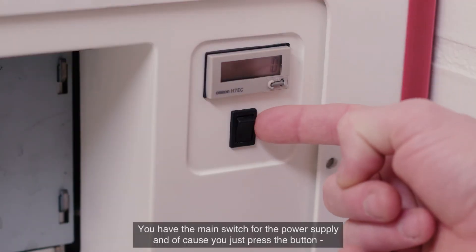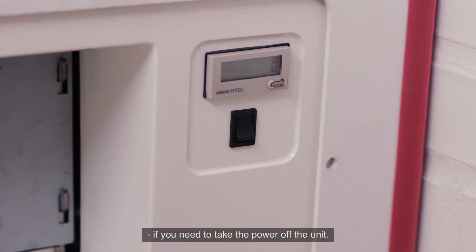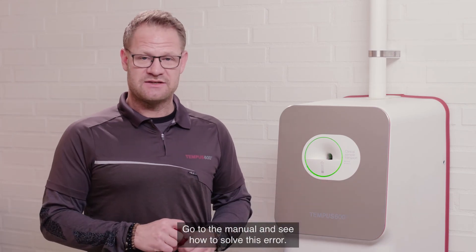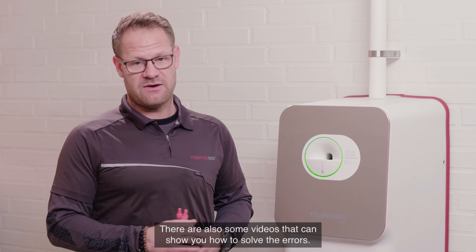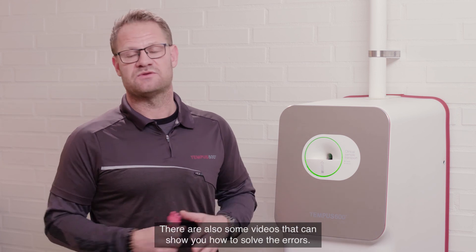You have the main switch for the power supply, and you press this button if you need to take the power off the unit. Go to the manual to see how to solve the error. There are also some videos which can show you how to solve these errors.